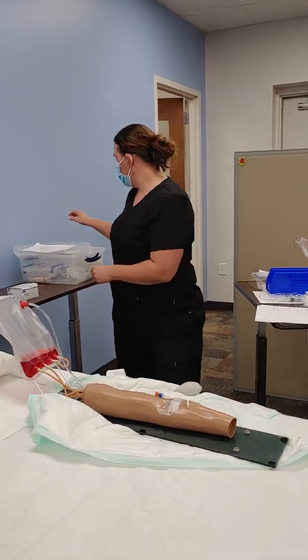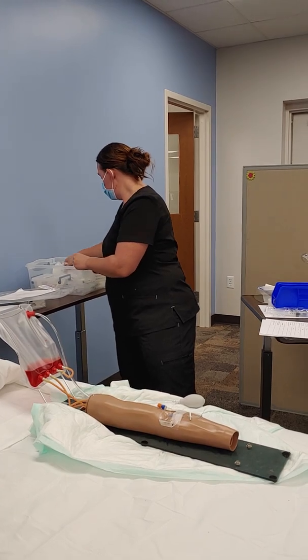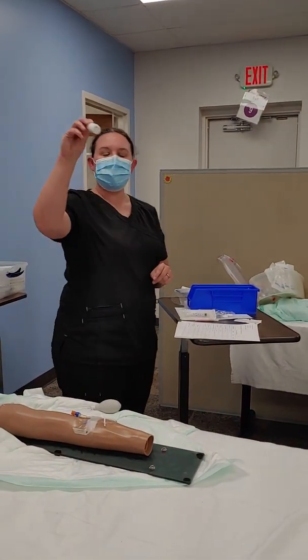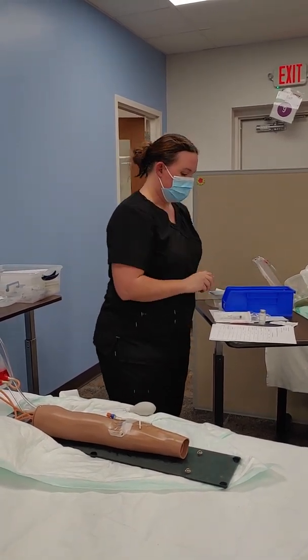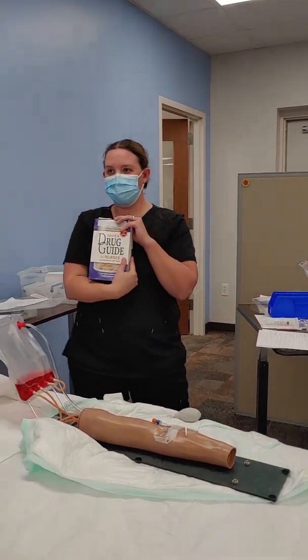Check expiration date. Check vial for clarity. Okay. Make sure I have my syringe to draw it up. It is not expired, and my vial is clear. Okay. Check drug resource to clarify whether med needs to be diluted before bolus administration.